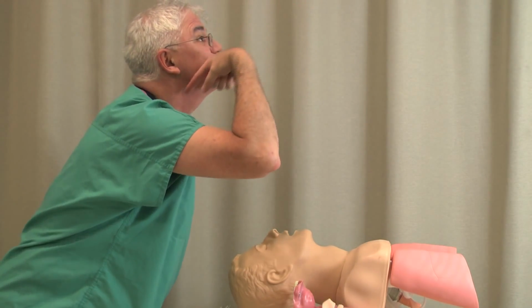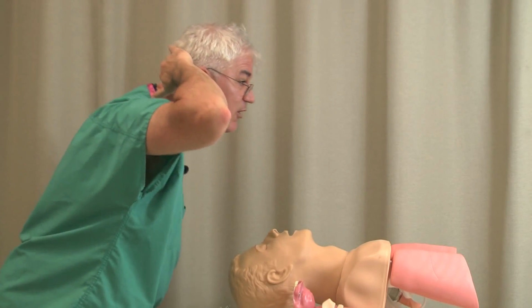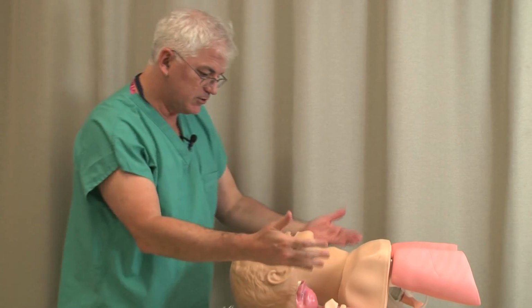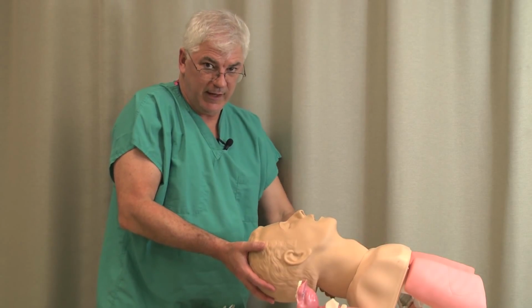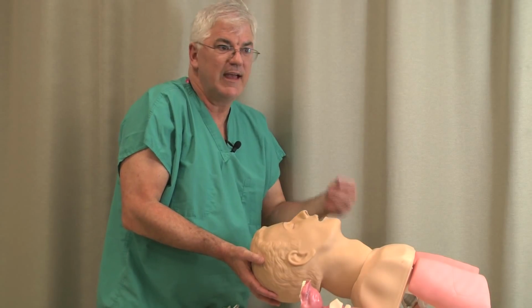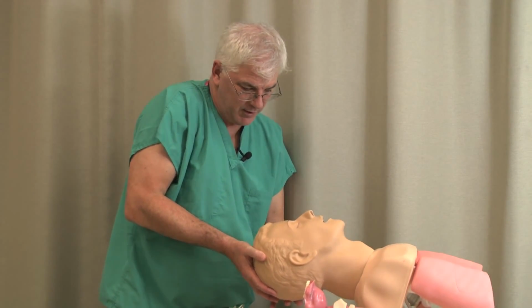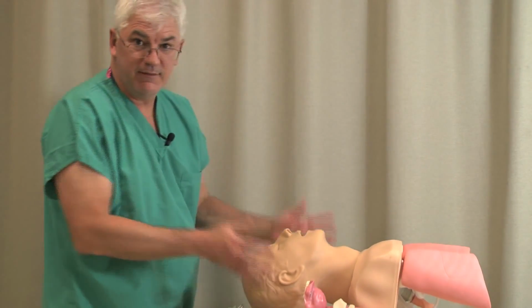This gives me the best possible position. That's how you want to get in the sniffing position. So my head is forward like that. And likewise, you want to get them in a good position. Now, a lot of times if people have a big BMI, you need to sort of ramp them up. You need to build up their shoulders. Whatever you have to do ahead of time to get their head in good position, the better the head position, the less skilled you have to be in laryngoscopy. And you want to have everything working for you, okay? So you see how I've got this in a really good position, whereas something like this would be the exact wrong position. So head position, very, very key thing.